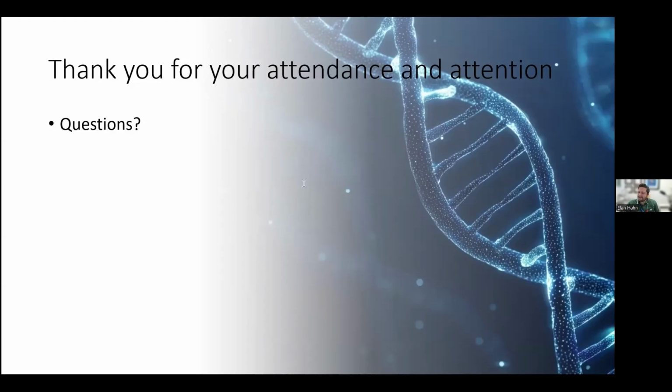And then I see, so the sinonasal case, that was a carcinoma ex inverted papilloma. Then there's a question about interpreting variant allele frequency. Is there an approach to determine if it's germline or somatic? It's hard to. I think you could see variation even in a germline variant that's a known germline. You could see it lower, much lower than 50%, 30% even, and higher.